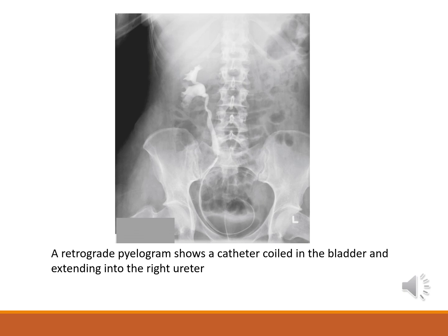This is typically performed in a cystoscopy suite under guidance from a urologist. The procedure helps assess ureteral obstructions caused by strictures, tumors, or stones, but does not evaluate renal function and usually involves imaging one side at a time, though both kidneys may be studied if needed.